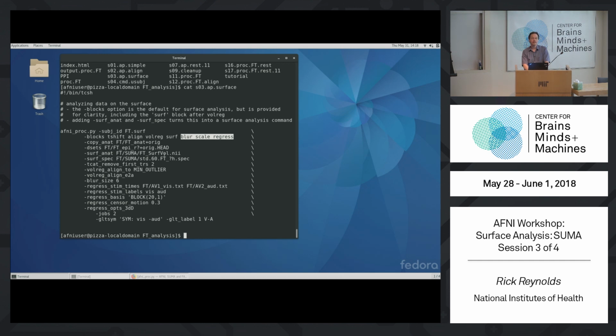Yeah? What's the thing that's considered in the surface mask? The cortical ribbon thickness, that's usually around 4 millimeters for humans. It varies a bit, and of course people do big studies on these tiny fluctuations in thickness, and the thicknesses aren't really that reliable to begin with. But anyway, on the order of 4 millimeters.